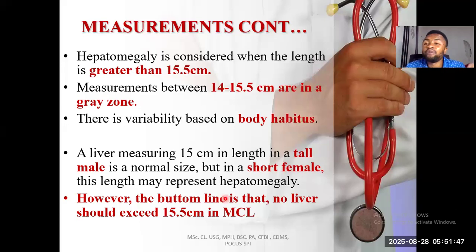So the doctor will correlate your ultrasound findings to the lab test and know that, oh, okay, this person is having severe malaria. That is why there is what? Hepatosplenomegaly, because severe malaria will cause the spleen to also be enlarged. So we call it hepatosplenomegaly. The spleen is enlarged, the liver is enlarged. But sometimes ultrasound can find out why the liver is enlarged, which you see and you have to add it. If you see that the liver is appearing like liver cancer, definitely hepatomegaly secondary to hepatocellular carcinoma, because it is the cancer that is causing the enlargement.